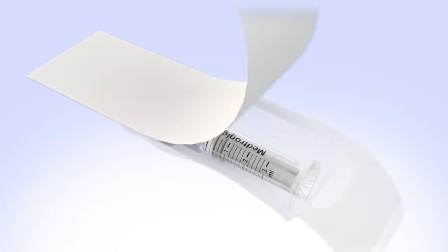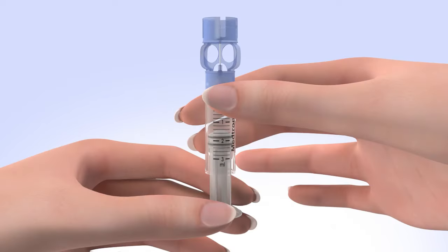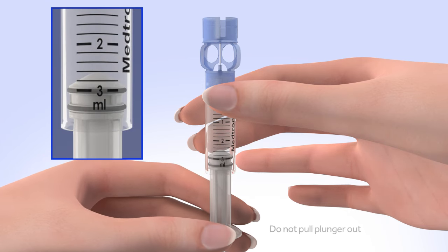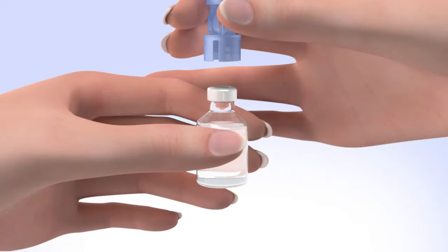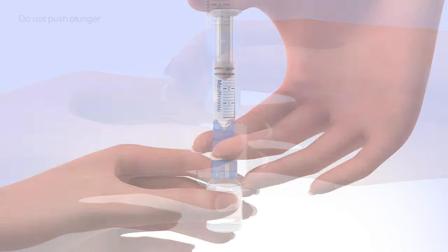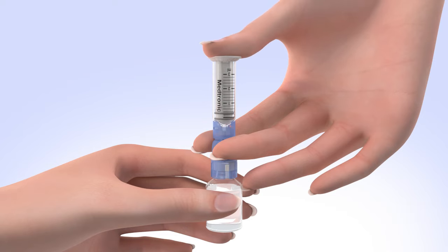Remove the new reservoir from the package. Pull the plunger so the top O-ring is positioned at the amount of insulin you plan to put into the reservoir. Be careful not to pull the plunger completely out. Hold the reservoir by the blue transfer guard and connect it to the insulin vial by pressing down. Do not push down on the plunger during this step. Keep the insulin vial upright, place your thumb on the plunger, and firmly push the air from the reservoir into the insulin vial.